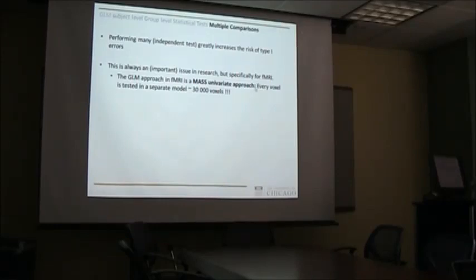It's specifically an issue for fMRI because, again, what I started off with, it's a mass univariate approach, right? You test this model in, say, 30,000 or more voxels, and even worse if you're in genetics, where you might run hundreds of thousands or millions of tests. If the number of tests becomes so immense, it becomes really an issue.